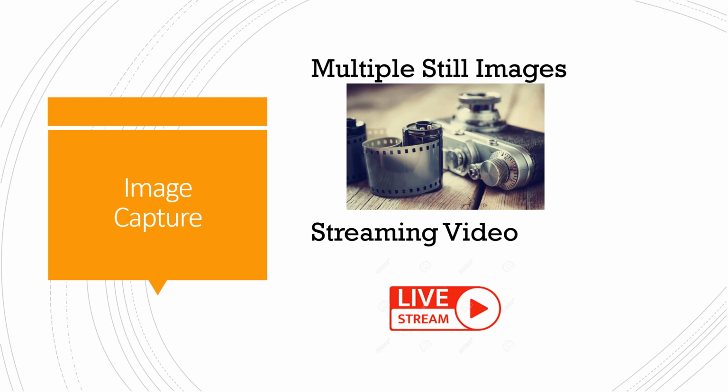Now, I don't know the specifics of other machines, but I know that the iTero takes 3,000 images per minute. That is way more images than you can take with an intraoral photo. So you are going to get a lot more detail in the scan than you will ever get with intraoral photos.